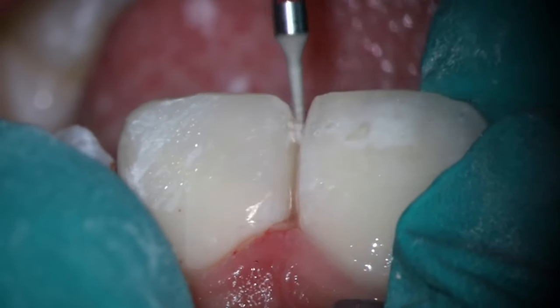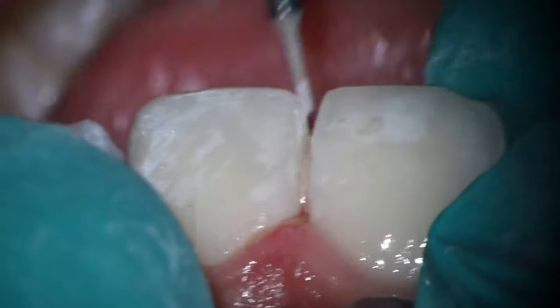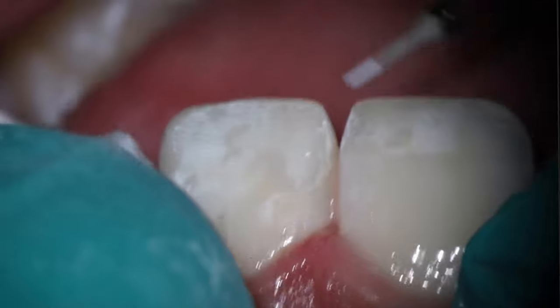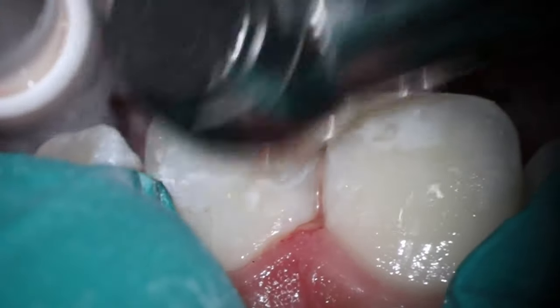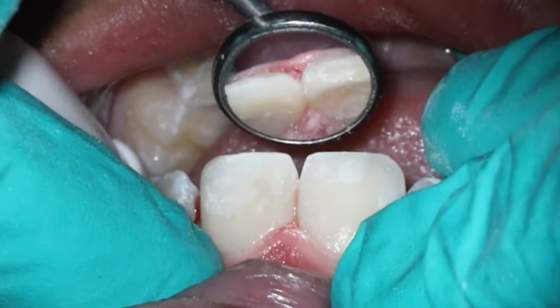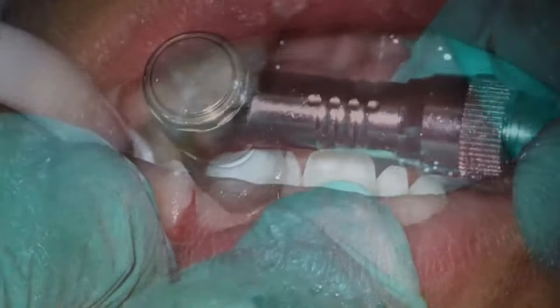Fine-tuning of that incisal embrasure now with my favorite burr of all time, the little mosquito. This super fine burr is really nice for getting just a nice mirrored image on the two of them. And you can see I'm still smoothing out that chip on number 8 where there are some issues as well. But the idea is you want to get 8 and 9 as perfectly symmetrical as possible. If 7 and 10 look a little bit off, no one notices. If 8 and 9 aren't perfect, everybody notices.